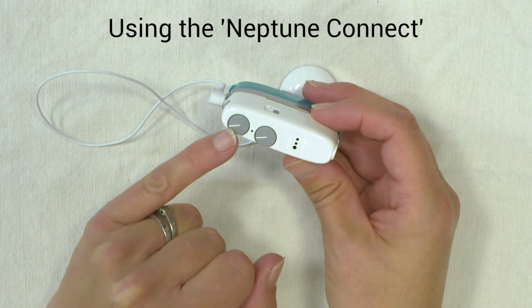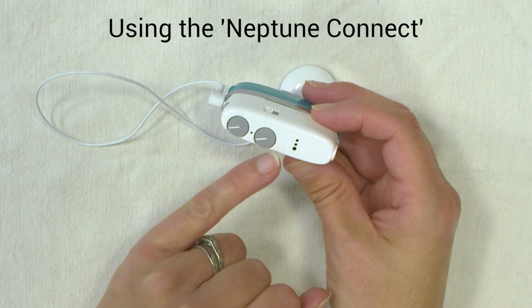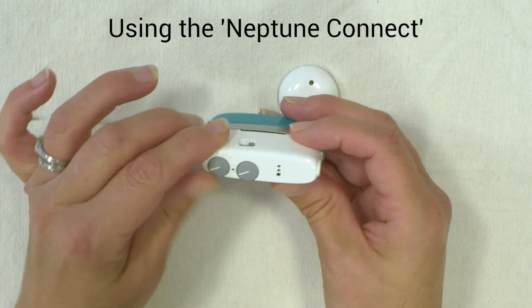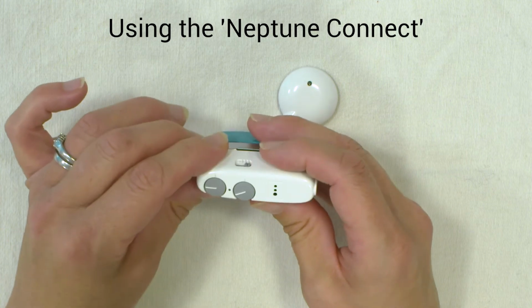This is a volume control and this is a sensitivity control. Quite often they're disabled by the audiologist, so even though you move them, you shouldn't be able to change the volume and sensitivity.